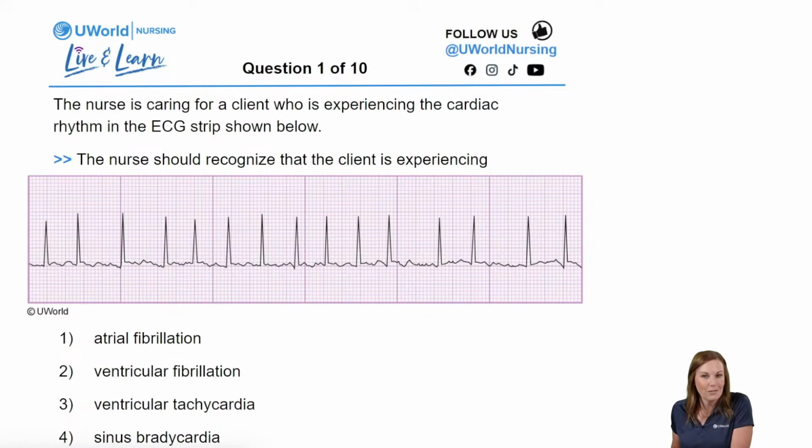Let us know if you were here on Tuesday. In case you missed it, we did a whole session on ECG interpretations. We followed the test plan that is available to all of you from the NCSBN. We covered 5 dysrhythmias and the normal sinus rhythm. Check that out on demand on YouTube and Facebook. All of our videos are available there.